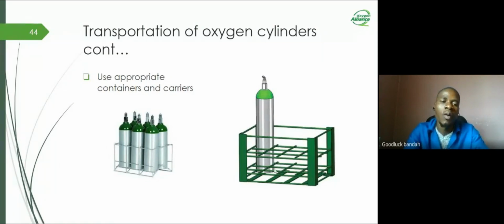As you can see, whenever you are transporting oxygen cylinders, it's important that we put them in the appropriate containers. Shown in the pictures are the cylinder racks, which safeguard the cylinders from falling.